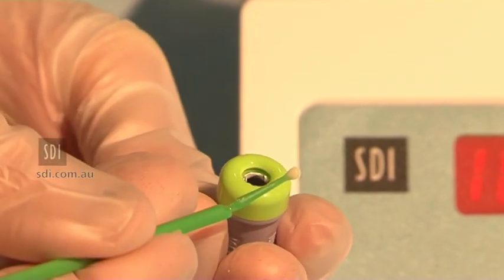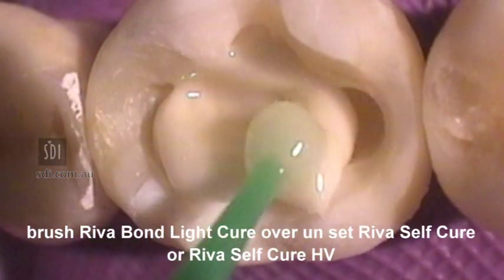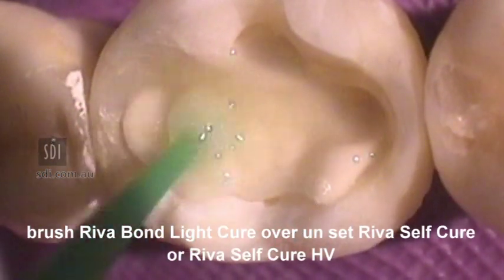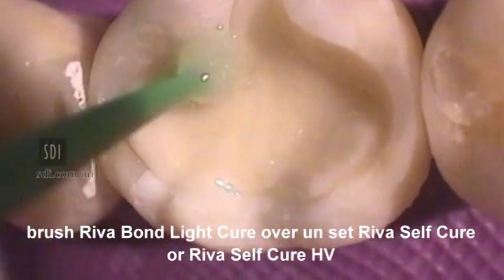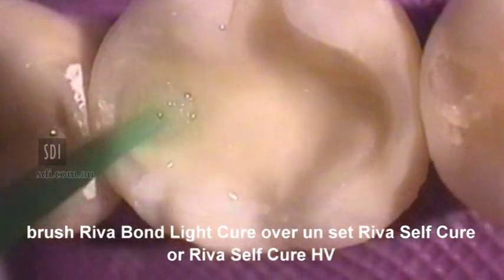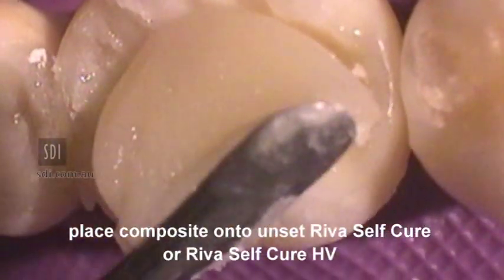Bend over the brush and remove it from the reservoir. Commence condensing the Reva SC or Reva SC HV with a brush impregnated with Reva Bond LC, a resin-modified glass ionomer cement bonding agent, prior to setting of the Reva SC or SC HV.